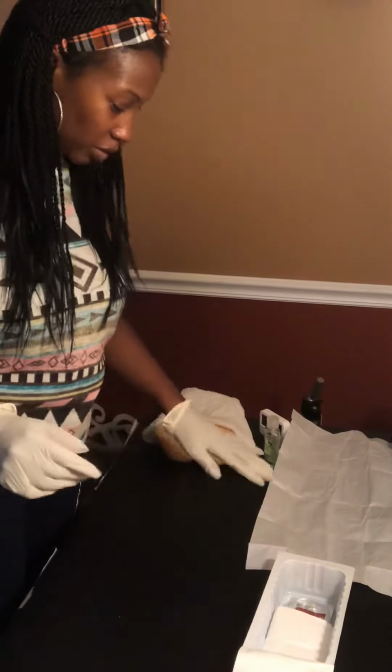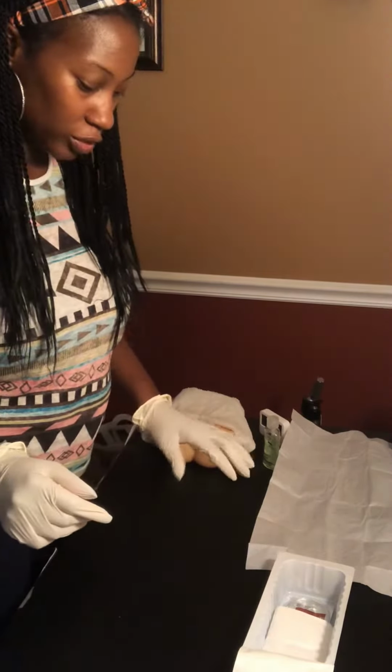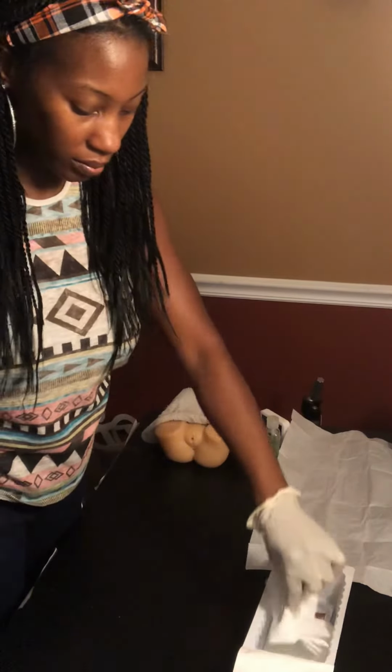Okay. So now I am going to get the drape.